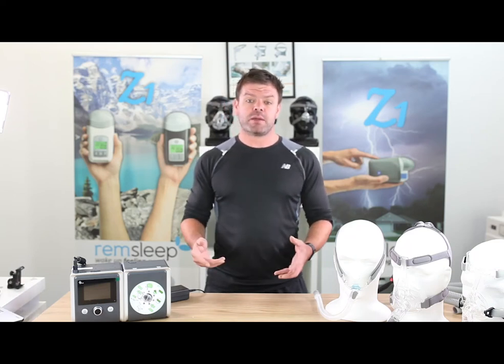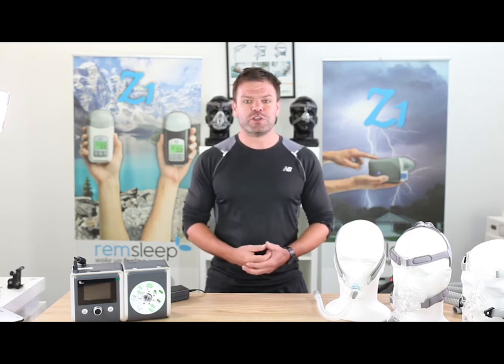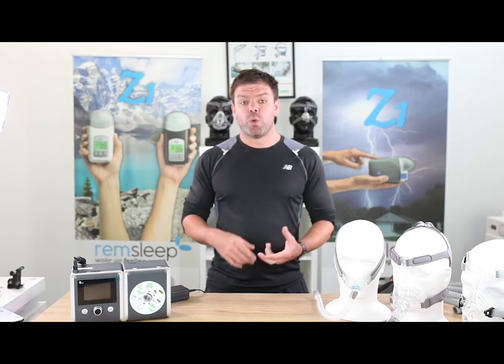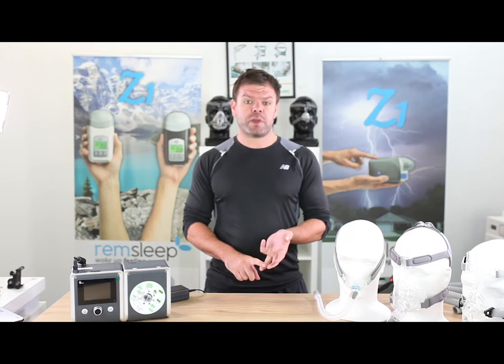G'day, Nick here again from cpaphire.com.au, and today I'm going to talk to you a little bit about sleep therapy data. What is it and what's it used for? Sleep therapy data shows us how you're using your machine, what your machine is doing to control your sleep apnea, and how well your sleep apnea is being controlled.